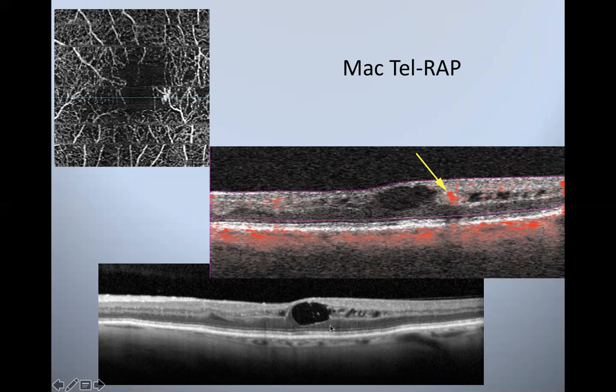And here's their OCT down on the bottom here. You can see that large pocket of fluid. And the intraretinal fluid you see here is that neovascular complex sort of diving down. When the new blood vessel starts diving down through intraretinal tissue, it's a new blood vessel, so it leaks fluid, it leaks serous fluid, plasma, just like any other neovascular membrane does.